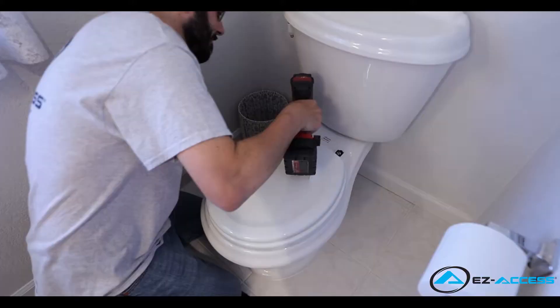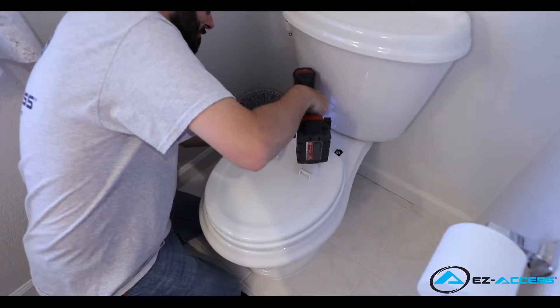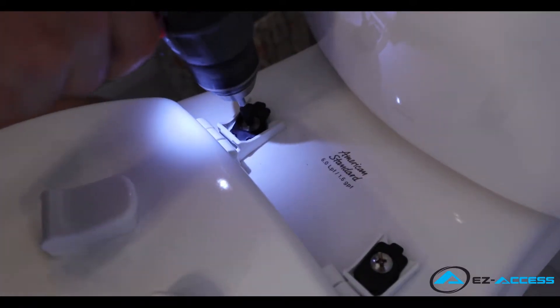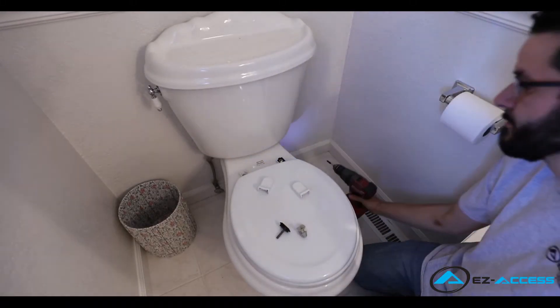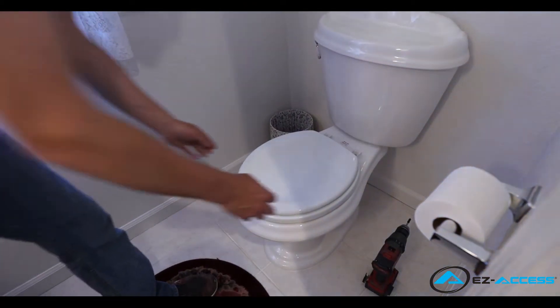Begin the installation by unscrewing the two bolts that secure the seat and lid to the toilet bowl. Once these bolts are unscrewed, removed, and set aside, take off the existing seat and lid from the toilet and set it out of the way.